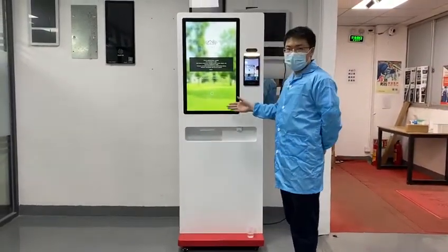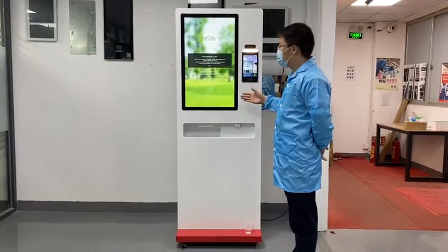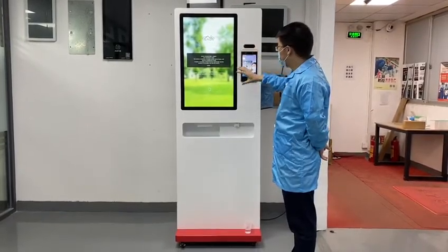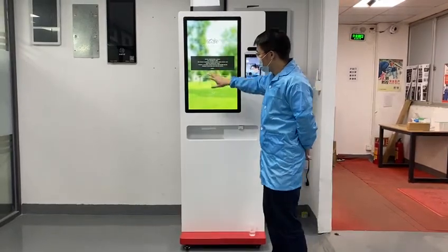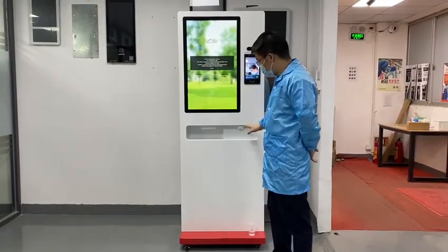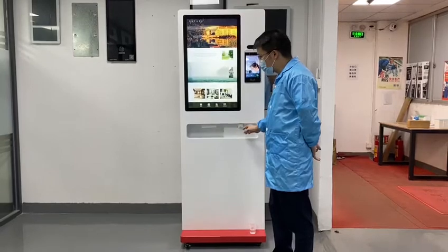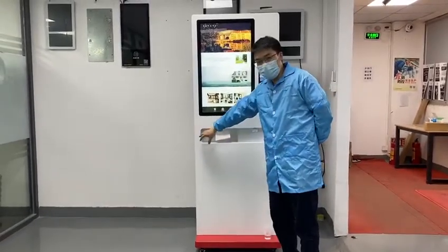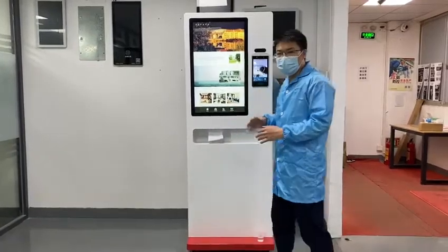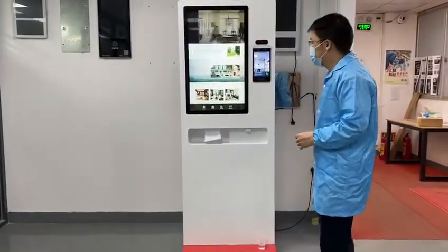Let me introduce our sanitizer to you. First, this is the body temperature testing module, and this is the 32-inch touch display. This is the auto spray sanitizer, the tissue here, and the recycle bin there. Let me show how this system works.